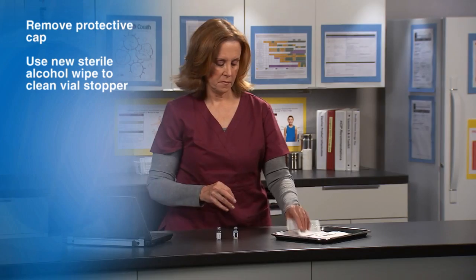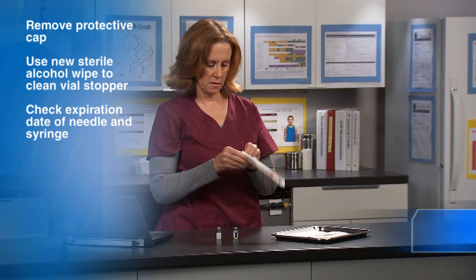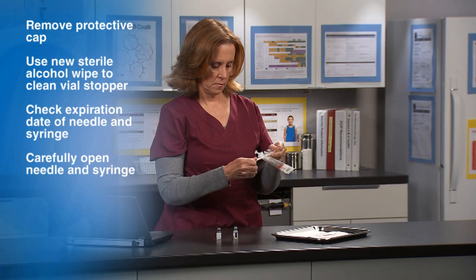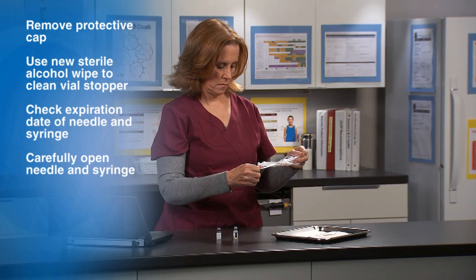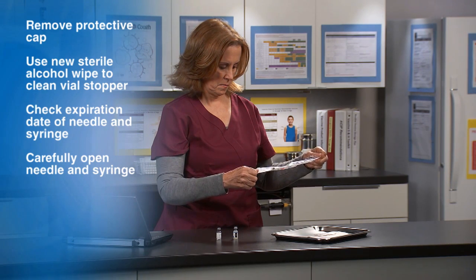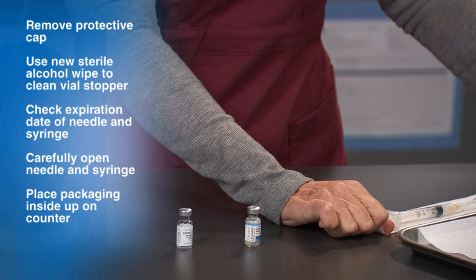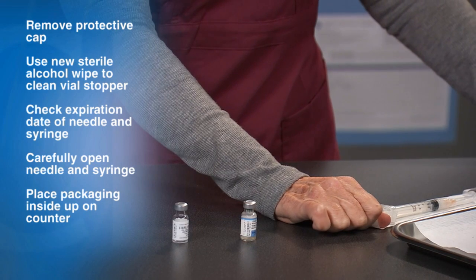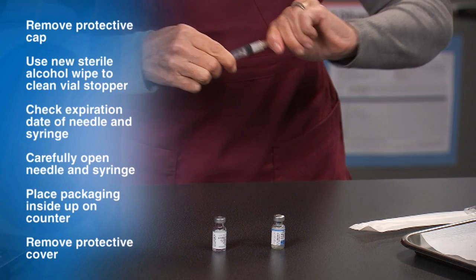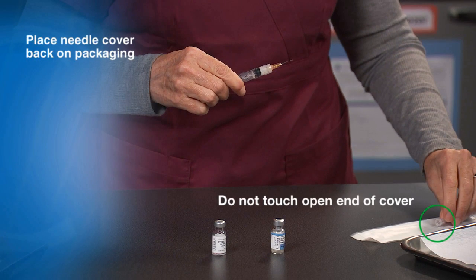While the alcohol is drying, check the expiration date on the needle and syringe if present. Never use expired equipment. Next, carefully open the needle and syringe. Be careful not to touch the inside of the packaging or where the needle attaches to the syringe. Place the packaging inside-up on the counter with the needle and syringe resting on the inside of the packaging. Remove the protective cover from the needle, being careful not to touch the open end, then place the needle cover back on the packaging.